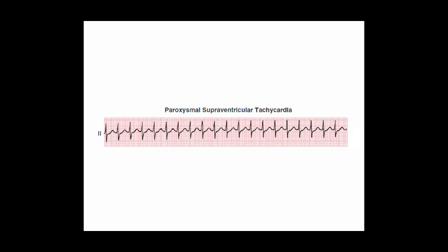In many cases, if I don't see anything except the QRS complex, it may be AVNRT, because with increasing experience, we will look for a retrograde P wave to make the diagnosis more accurate from the ECG, but this is enough to get the patient to the EP lab.